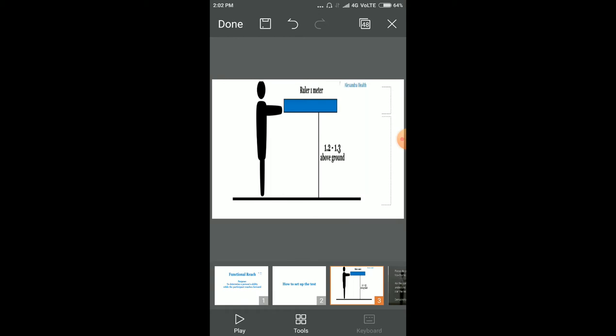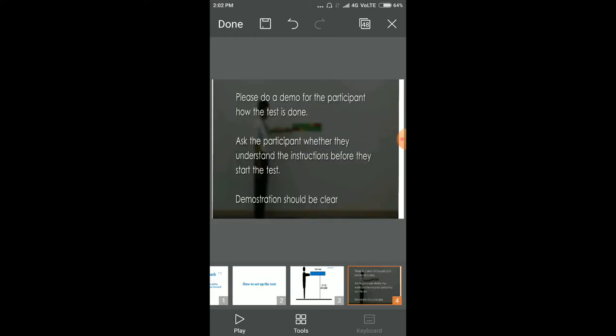How to set up the test: Place a meter stick on the wall approximately 1 meter above the ground. Do a demonstration for the participants showing how the test is done. Ask the participant whether they understand the instructions before they start, and the demonstration should be clear.